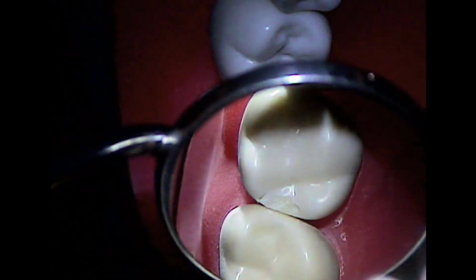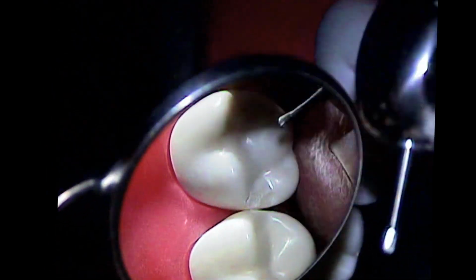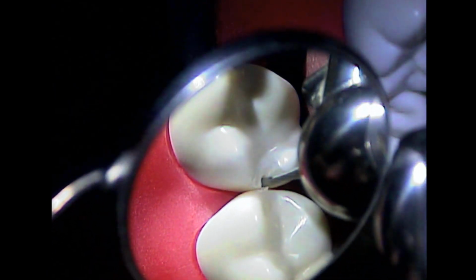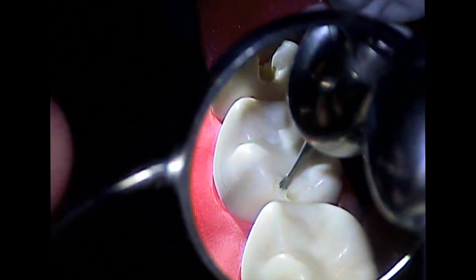Now, so what's the first thing you do on the DO? Cut to the middle of the contact and then. Okay, make a hole at the middle of the contact, facial angle, you're right next to the adjacent tooth, the depth of the burr. And then extend it towards the facial. Yeah, but look how shallow you are. You're like not going into the tooth at all. You've got to get some depth.